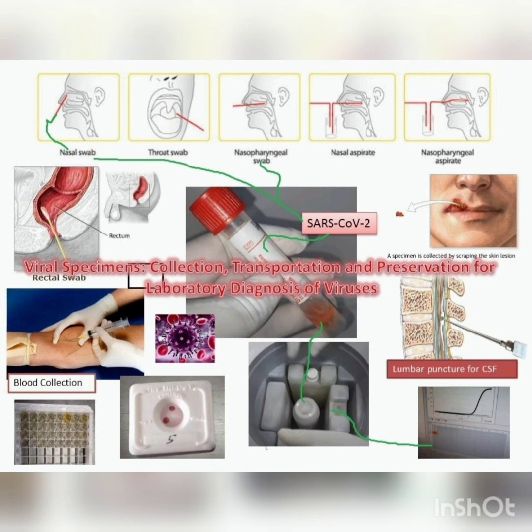And then you should not refrigerate the samples. Specimens for anaerobic infection need not be refrigerated. You need to send the collection immediately to the laboratory, and the lab technician or microbiologist needs to process the specimen immediately.